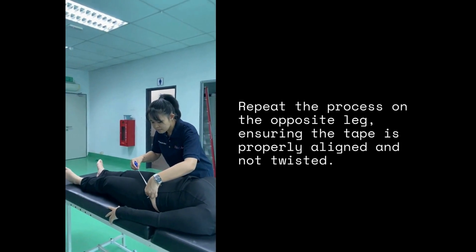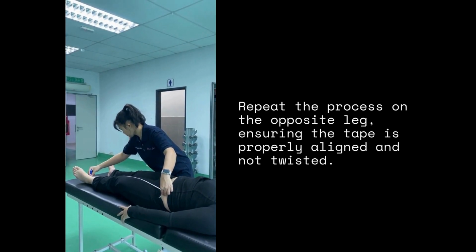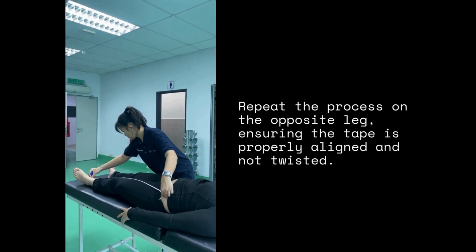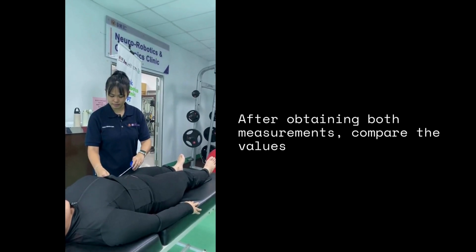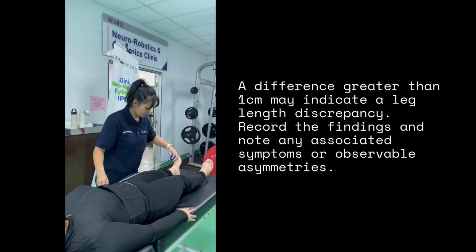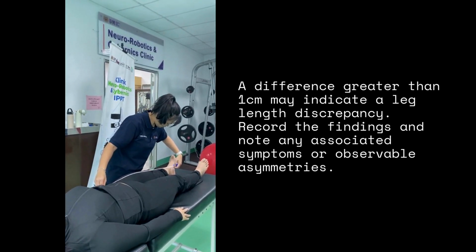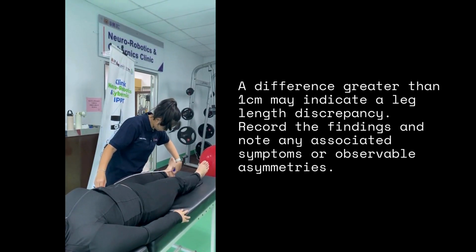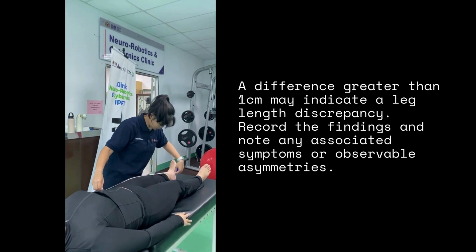Repeat the process on the opposite leg, ensuring the tape is properly aligned and not twisted. After obtaining both measurements, compare the values. A difference greater than 1 cm may indicate a leg length discrepancy. Record the finding and note any associated symptoms or observable asymmetries.